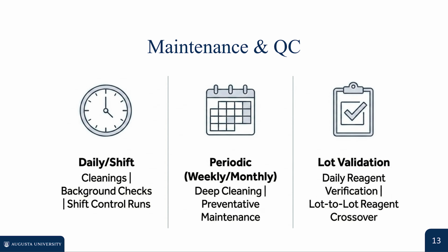Periodic protocols include weekly and monthly deep cleanings with chemical deproteinization of baths and line decontamination to prevent protein accumulation. Lot validation involves daily reagent verification alongside rigorous lot-to-lot validation studies prior to placing new diluent or lysing reagent lots into clinical operation.